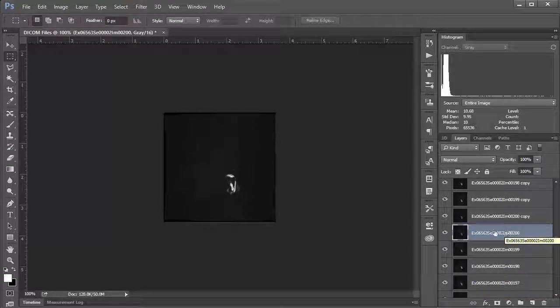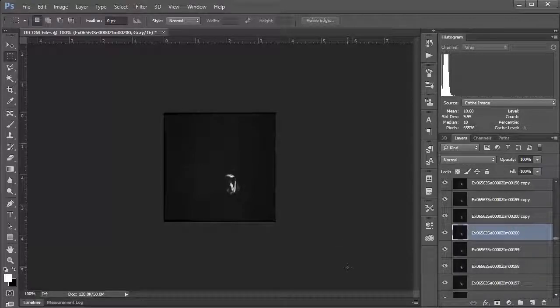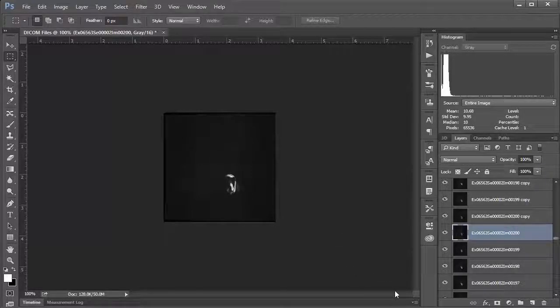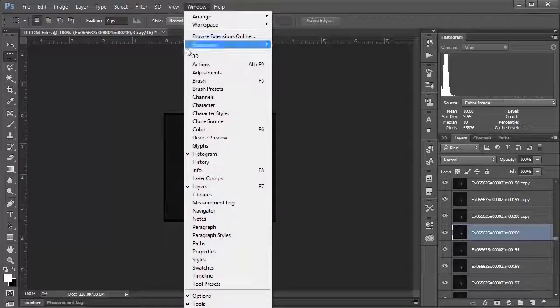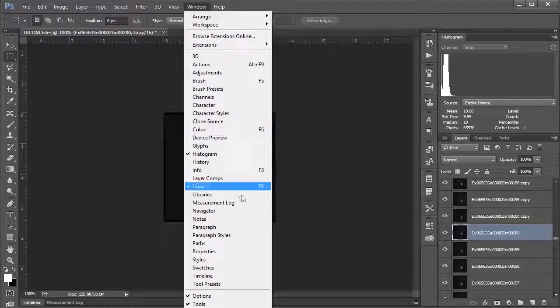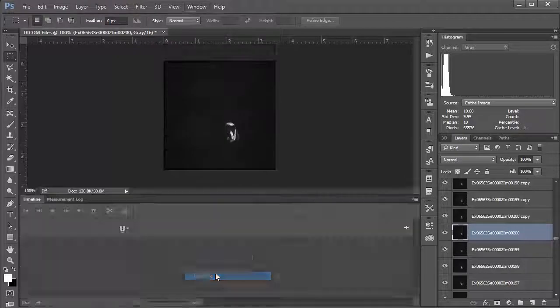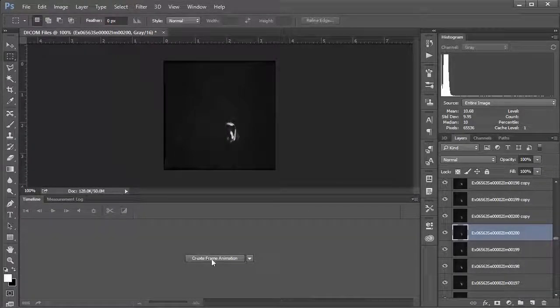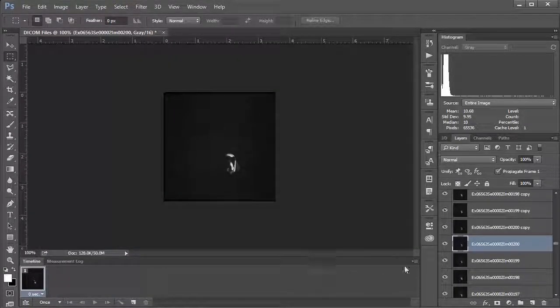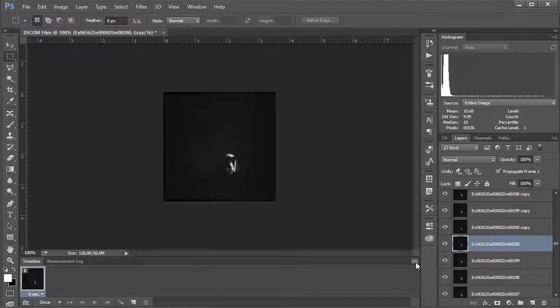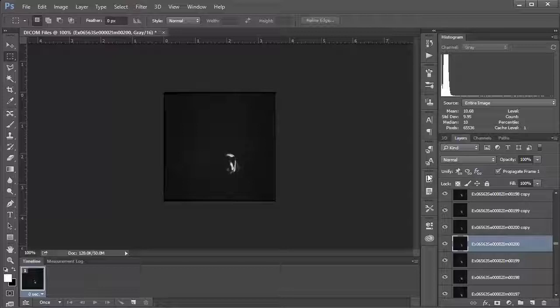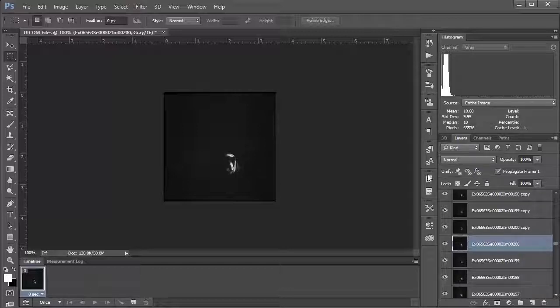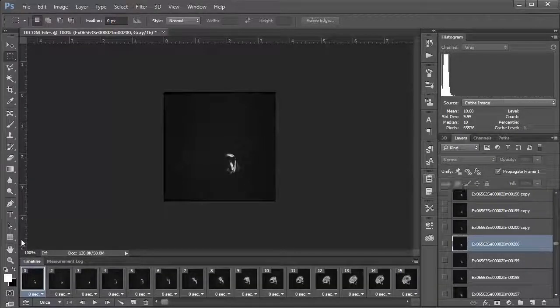So the next thing we want to do in terms of making this animation through the brain: we want to go up to Window and select Timeline. Then we're going to click this button here that says Create Frame Animation. Then we're going to go to this little hamburger menu and say Make Frames From Layers. So now Photoshop is going to take all of these layers—I guess there are 400, two copies or a copy of 200 layers—and import them into this timeline here.